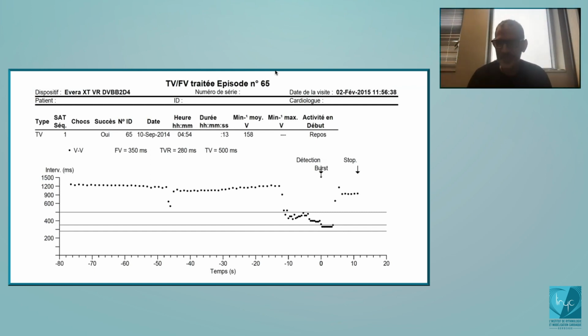It means that if there is no sudden onset, that's the end of the analysis. It's not going to be a VT. If it is unstable, that's not going to be a VT, it's going to be SVT. And if there is a match, that's going to be SVT also. For a diagnosis of VT, you need all 3. If you program all 3, you need a sudden onset, a stable rhythm, and a difference in morphology.